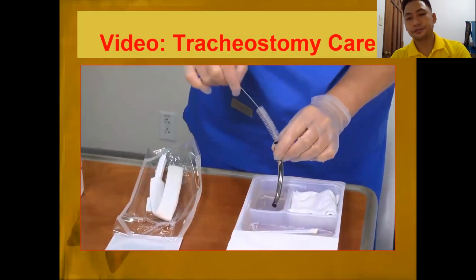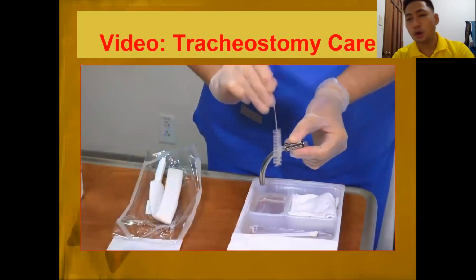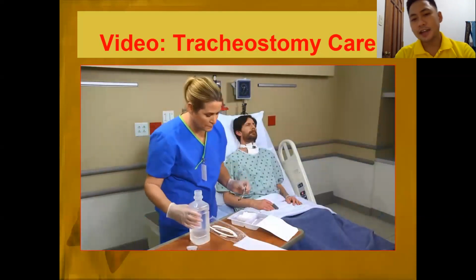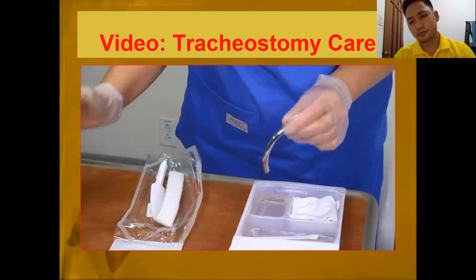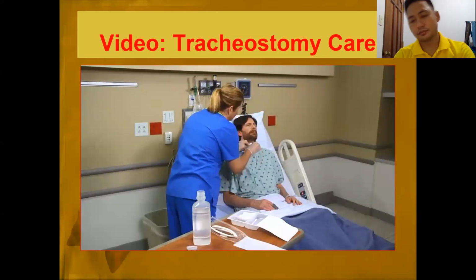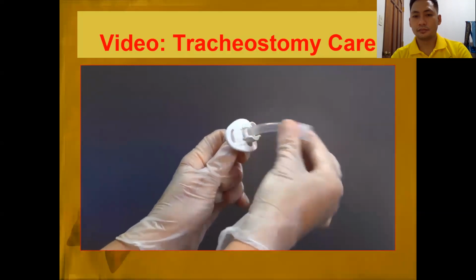And use the sterile brush to remove secretions from it, both inside and out. So we actually use diluted hydrogen peroxide or sterile normal saline to clean the inner cannula. Then rinse it with normal saline. Replace the inner cannula and re-engage the locking mechanism. If necessary, reattach the oxygen source and hyperoxygenate the patient. Note that tracheostomies may lock in different ways. Some must be squeezed to release and reattach.